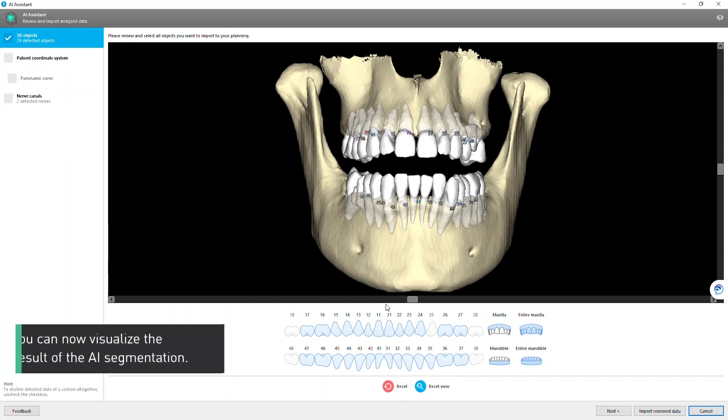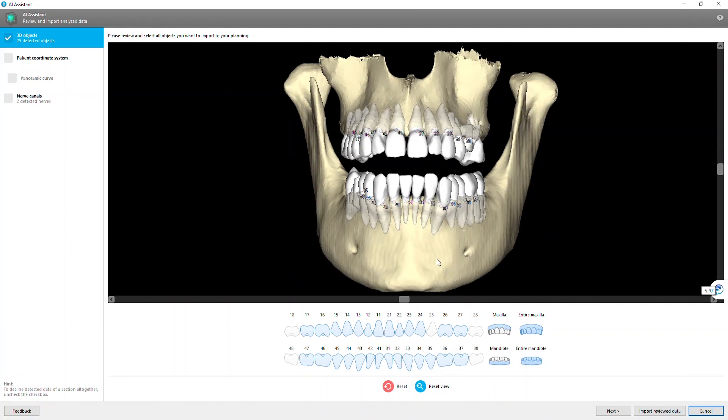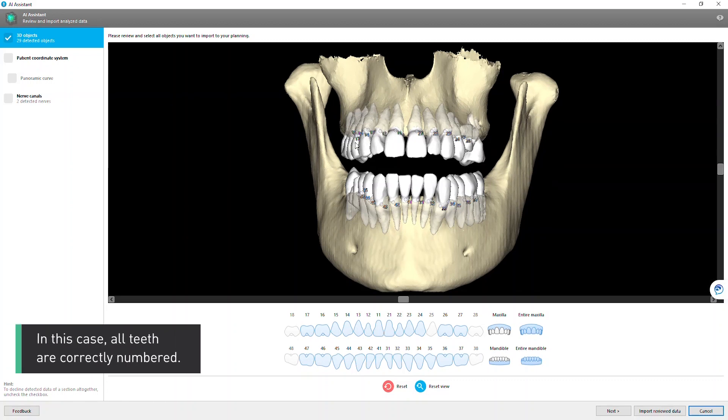You can now visualize the result of the AI segmentation. In this case, all teeth are correctly numbered.